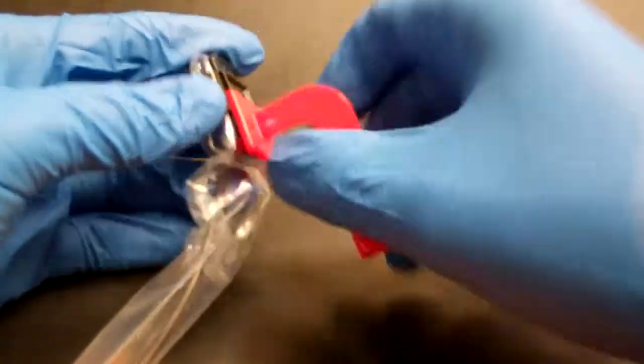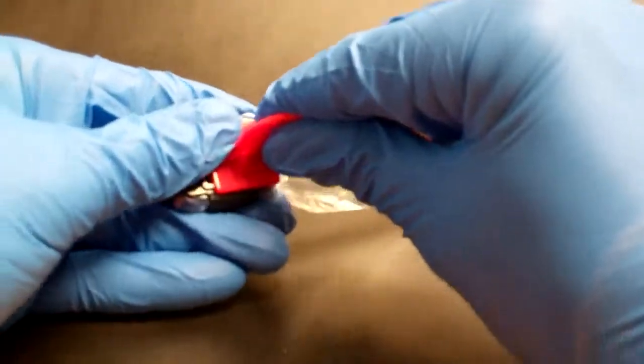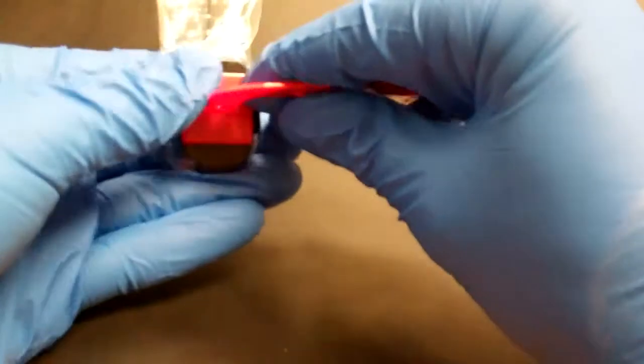And again, with the bitewings, if we were doing a horizontal bitewing, we would just attach our bitewing bite piece like so. If we wanted to do a vertical bitewing, attach it from the side.